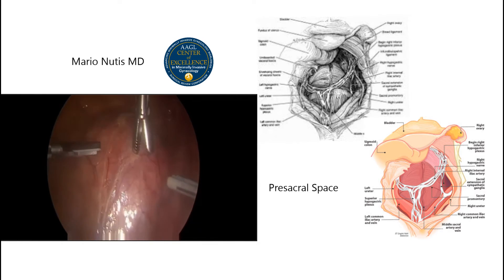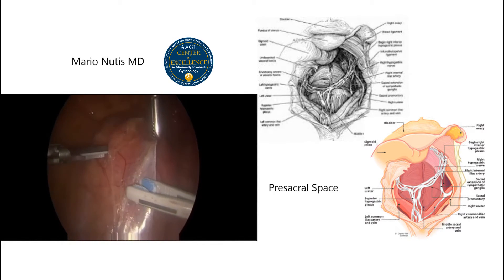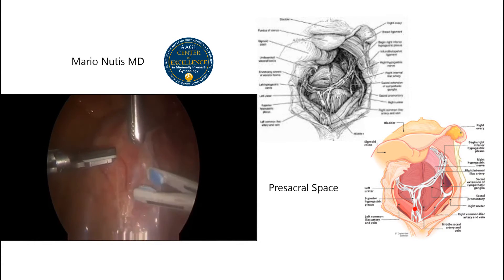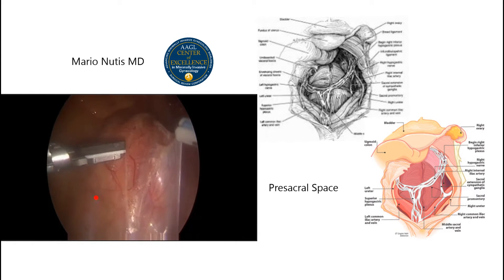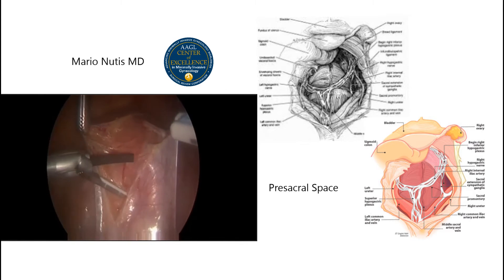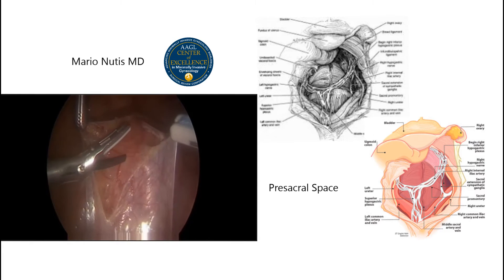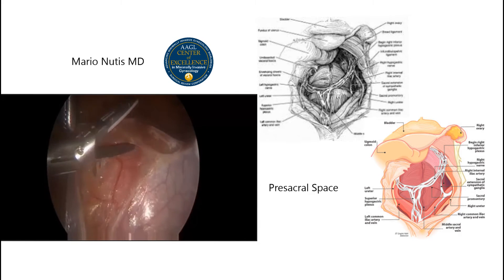Most of the hypogastric plexus is going to be close to the left common iliac vein, in this area right here, towards the left side. When entering this space, it's important to have good hemostasis so that way we can visualize all the structures.